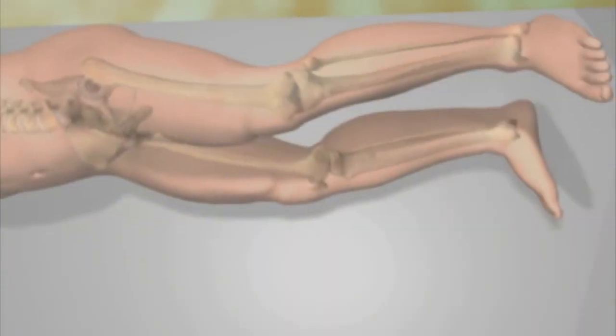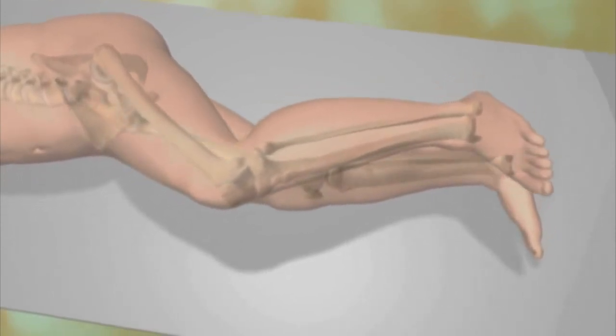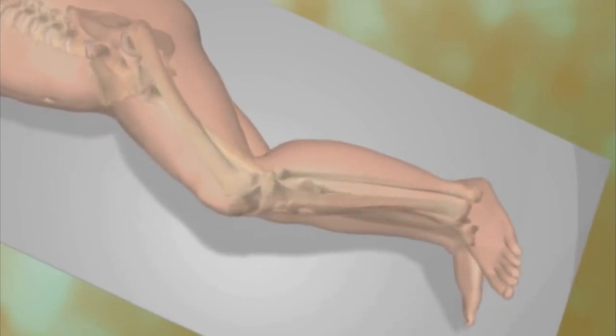During and after surgery, the surgeon verifies the correct fit and range of motion of the hip replacement components. By mimicking the anatomy and functioning of the natural hip joint, hip replacement can reduce pain and permit a return to many activities.